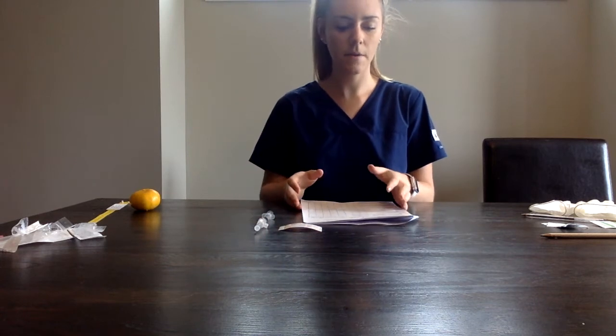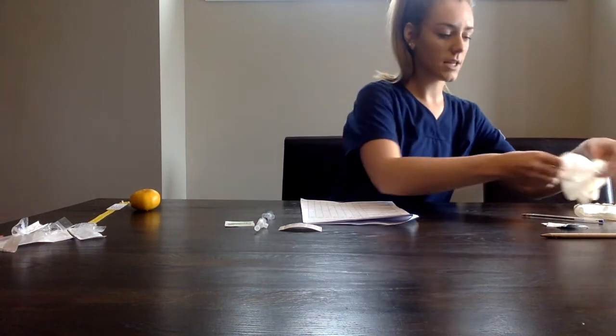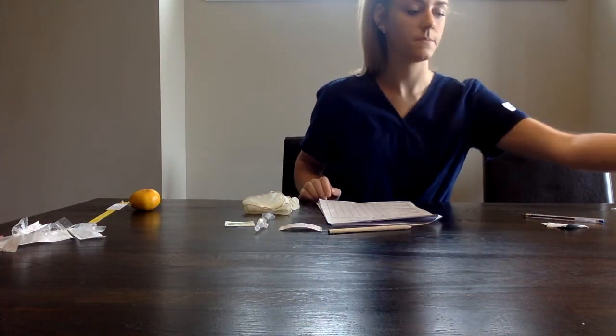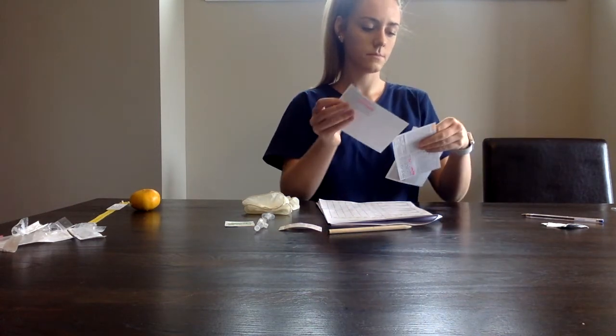And we'll begin to prep everything that we need to take to the patient's bedside. So we'll bring a cotton ball, we'll bring an alcohol swab, we'll bring a pair of clean gloves. We'll bring a pencil for documenting, but typically in a hospital we'd be using a black pen. Just for demo purposes, we'll be using a pencil. And then we'll bring our medication cards. Okay. So we're going to bring everything we need to the patient's bedside.